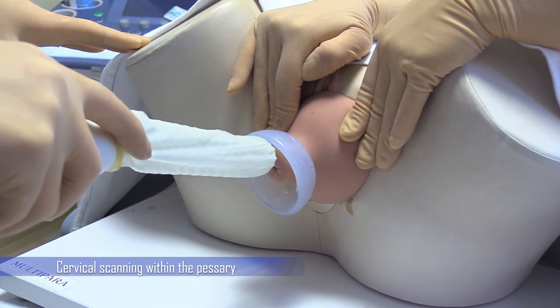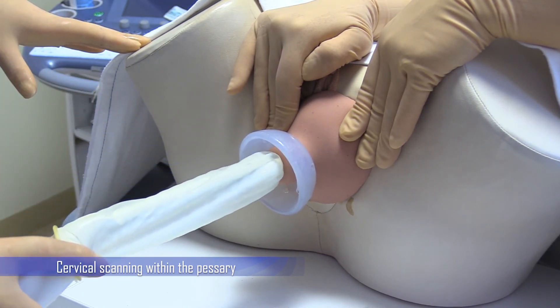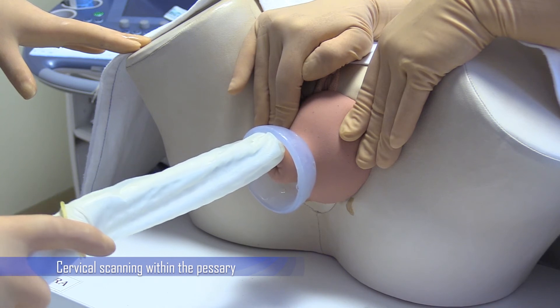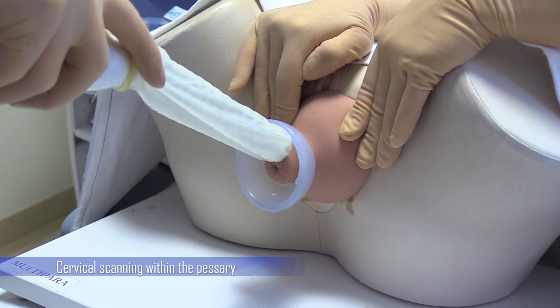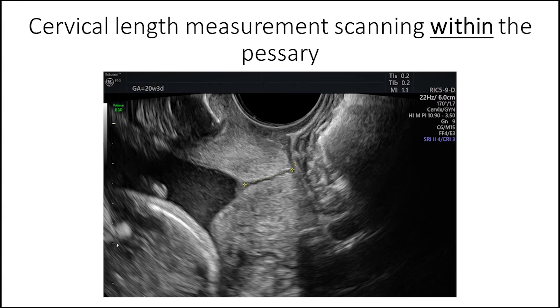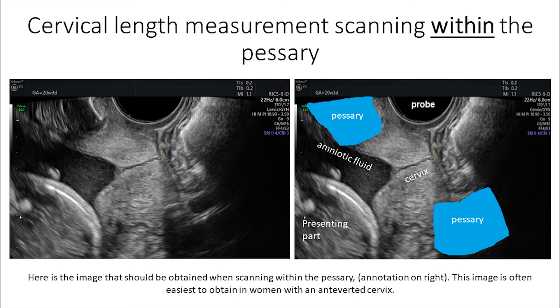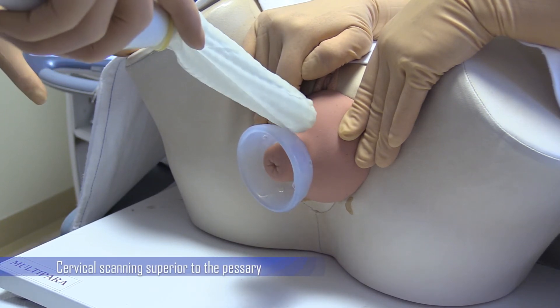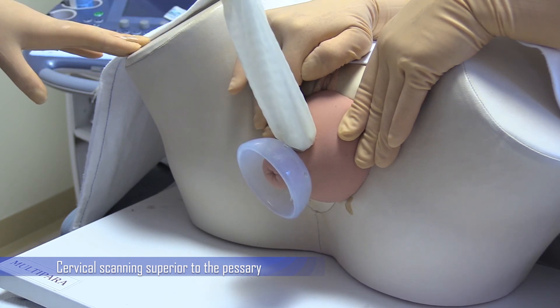This shows the manoeuvre within the vagina to obtain a cervical length image from within the pessary. Sometimes it is not possible to sight the probe within the pessary, and in this situation an image can be obtained superior to the pessary.